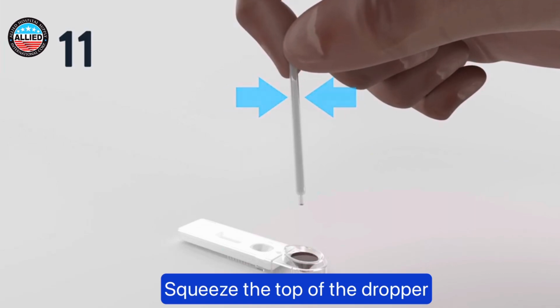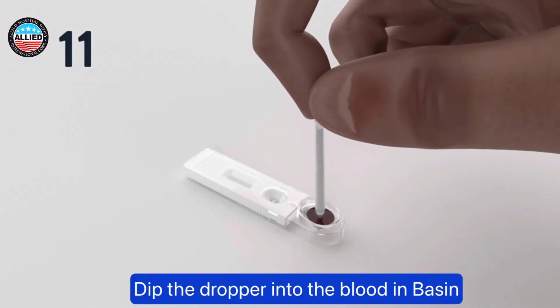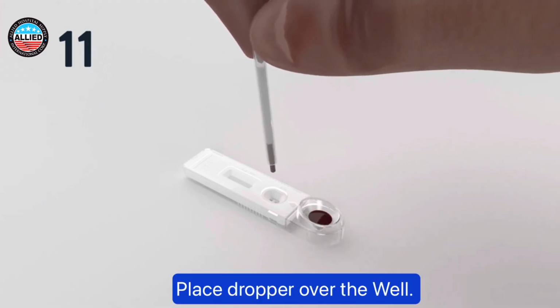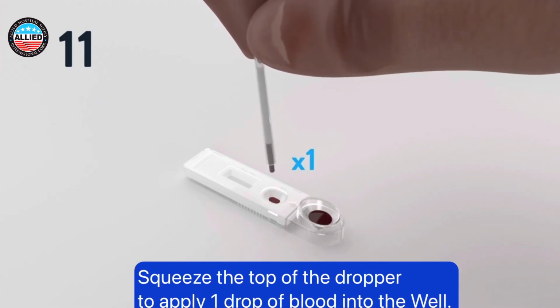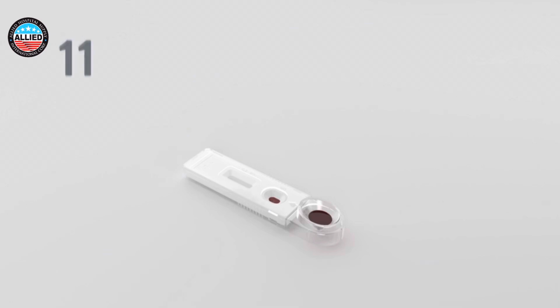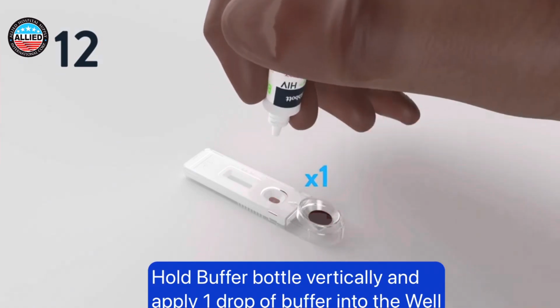Squeeze the top of the dropper. Dip the dropper into the blood in basin, and release slowly to draw blood into the dropper. Place dropper over the well. Squeeze the top of the dropper to apply 1 drop of blood into the well. Hold buffer bottle vertically and apply 1 drop of buffer into the well.